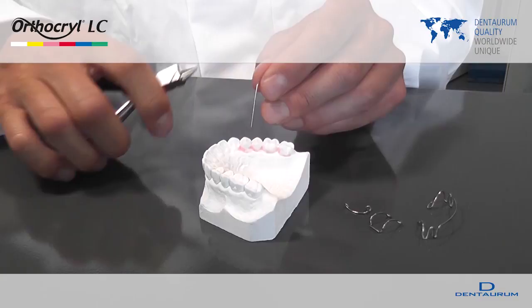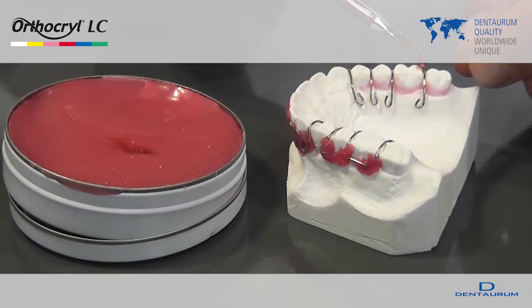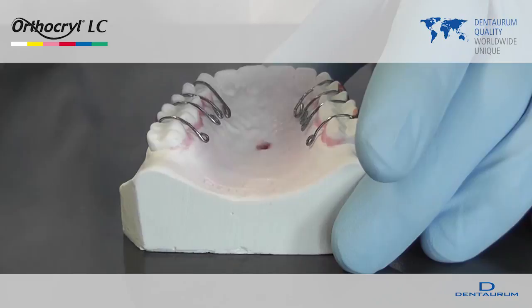OrthoKryl LC is generally applied to the plaster model that is isolated but not hydrated. Wire elements that have already been formed can be fixed to the model in the usual way with wax. A separating agent is applied to the dry model and spread evenly using a brush. Remove residues and beads from the separating agent after 30 minutes.